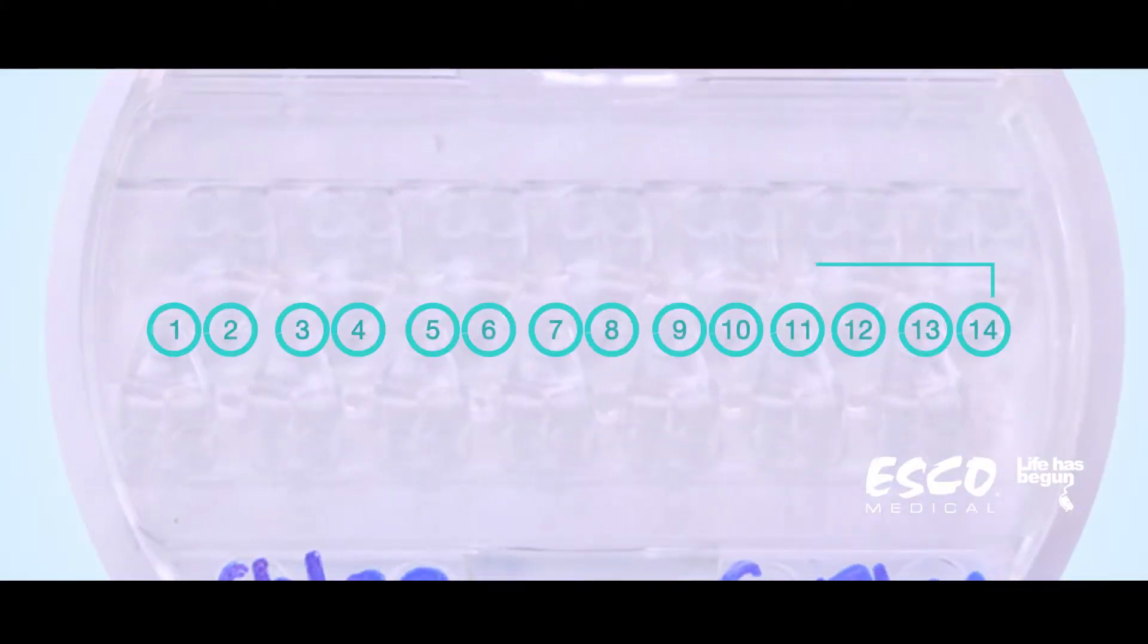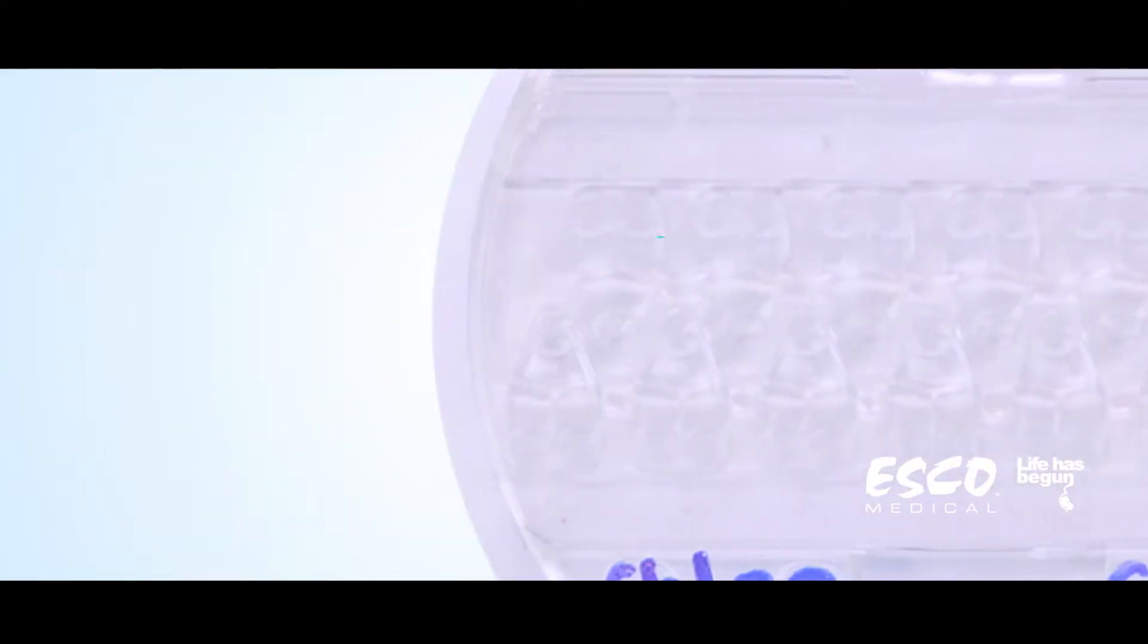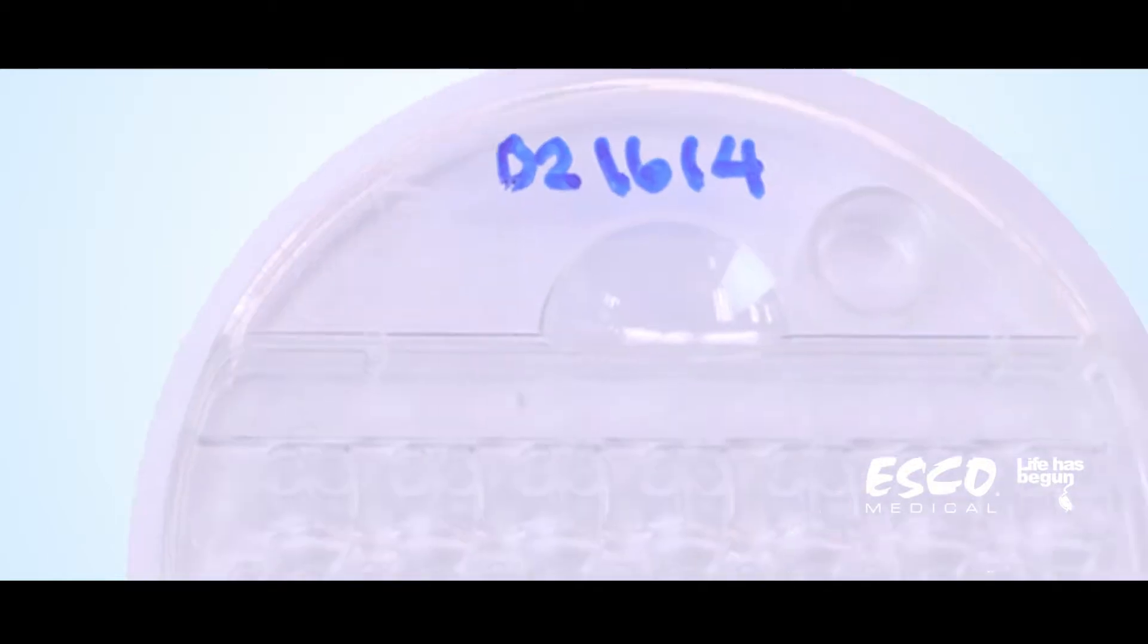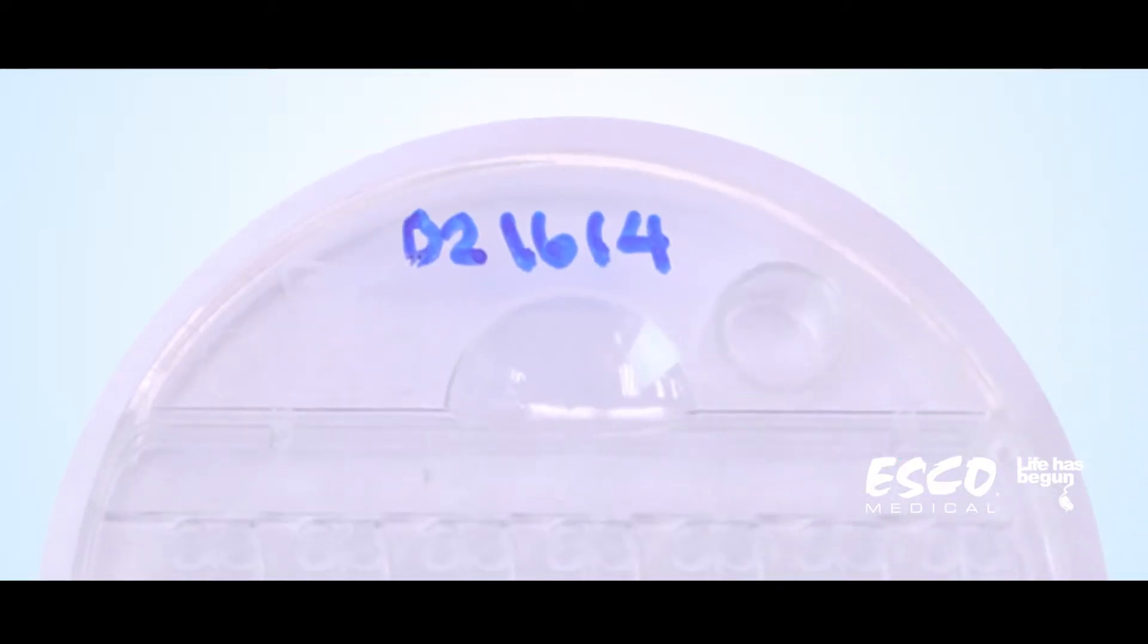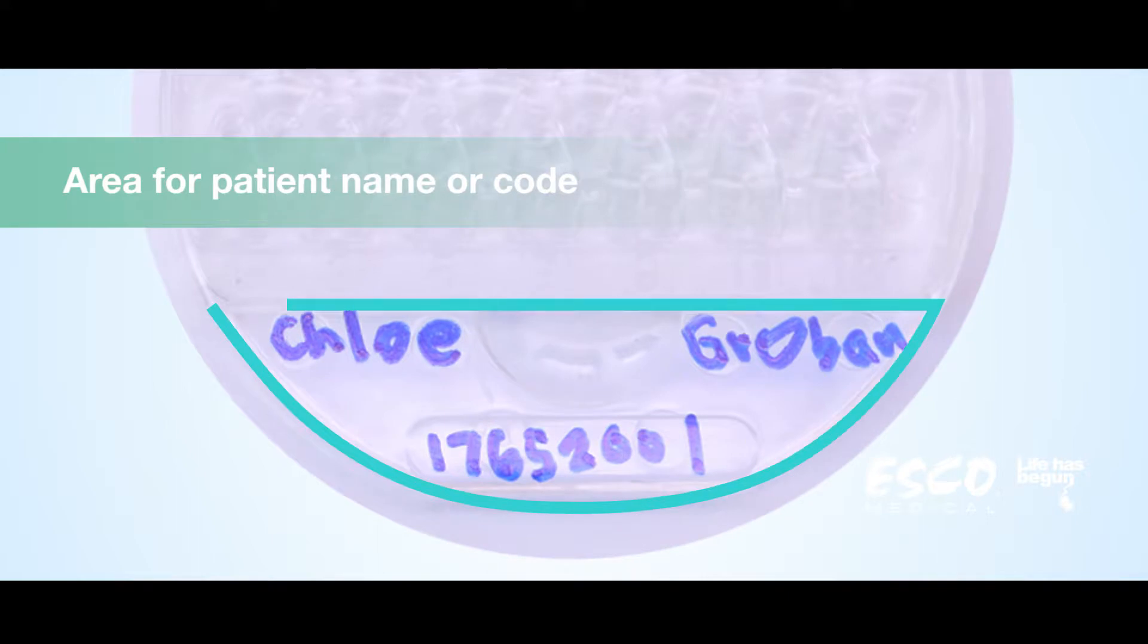The culture coin has 14 culture wells, 2 wells for embryo washing for each culture well, and a pH reservoir for pH measurement. It also has an area where you can write the patient name or code.